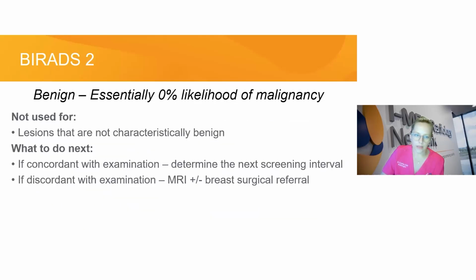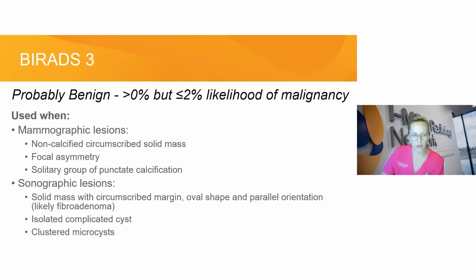We don't use it for anything that has an atypical feature, and we have essentially the same recommendation for what to do next. If it's concordant, we go back to screening. If it's discordant, we do something else.